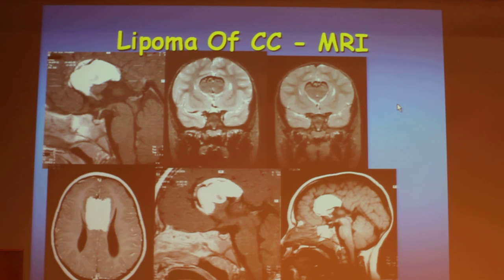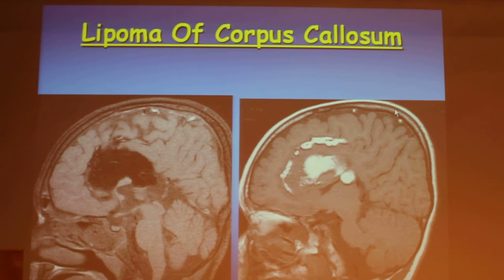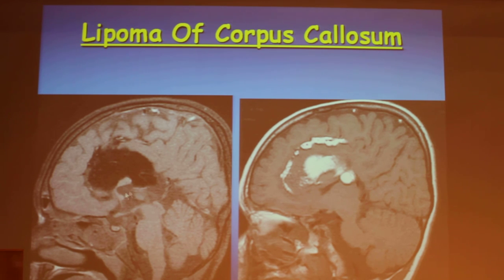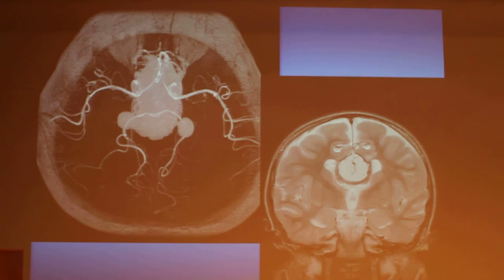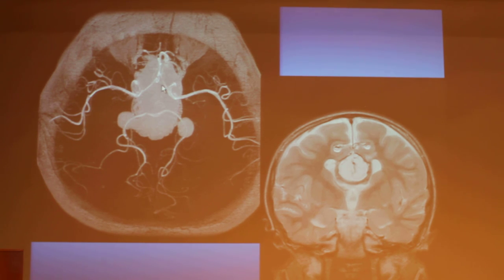We use all available techniques to prove that it is fat. It actually looks like a mass; however, it doesn't cause any mass effect. Here is an example of lipoma of the corpus callosum with fat suppression, and we see what is left of the corpus callosum. Despite the apparent mass, it doesn't cause any mass effect on the vessels — the circle of Willis is unaffected.